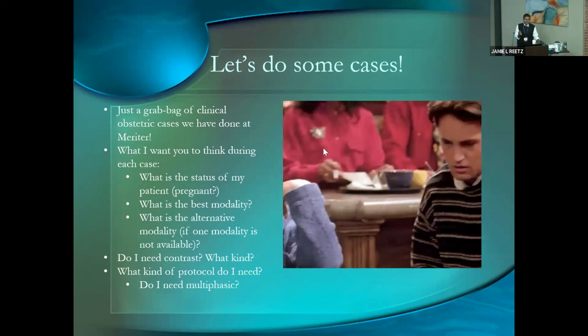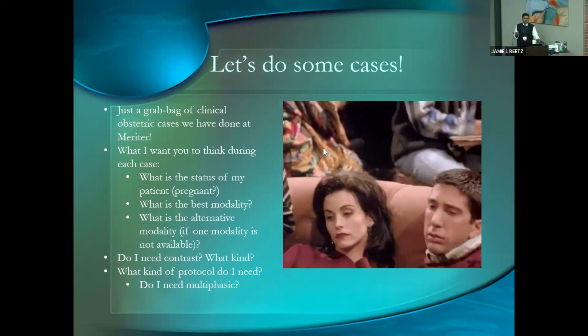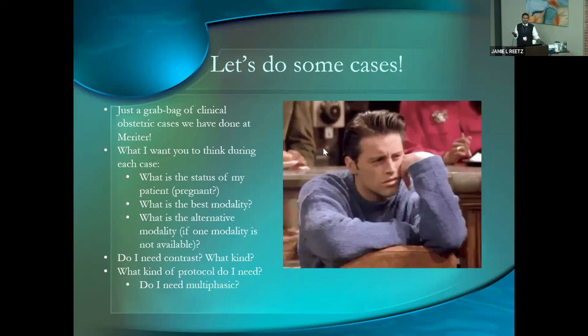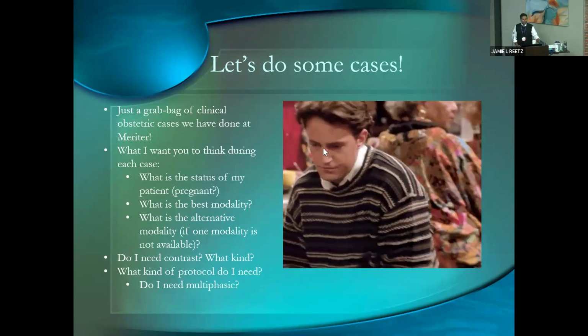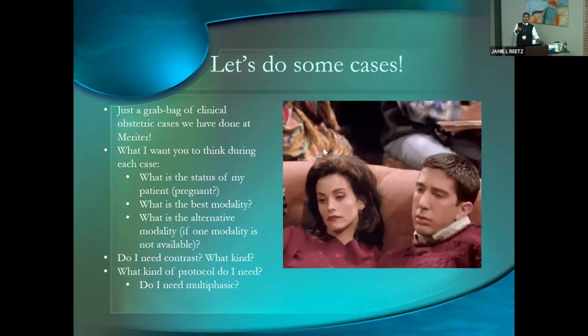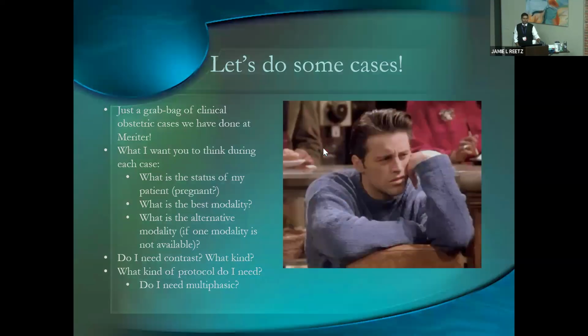All right, break over. The idea here is, what is the pregnancy status of your patient? What is the best modality for your patient? Is there an alternative modality? Spoiler alert, it's almost always going to be MRI. But I want you to really think about these things when we do these cases. Do I need contrast? What kind of contrast? Is it a multiphasic CT or MRA? What do I need to do here?